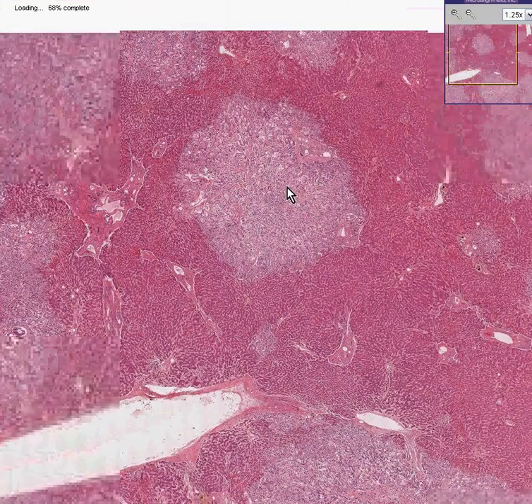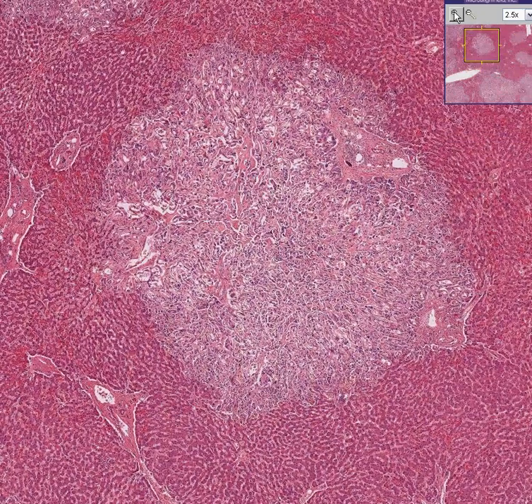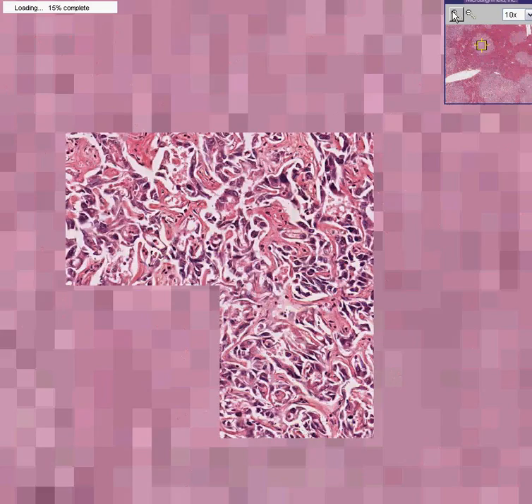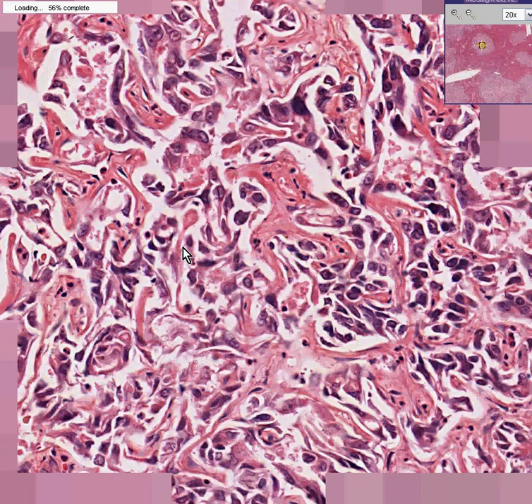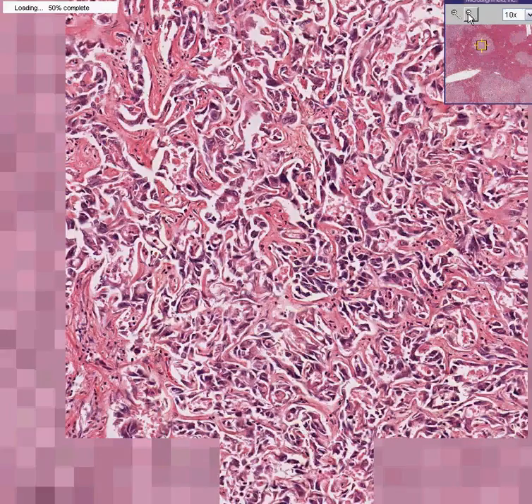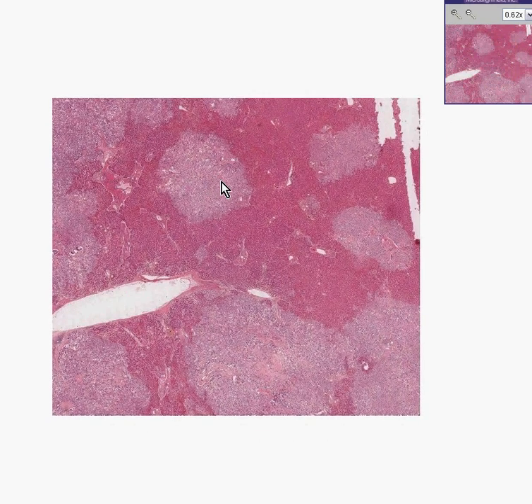as well. So, in all honesty, even though we would all like to think we are brilliant people that can diagnose anything, what you can really say truly about this malignancy is that it looks kind of glandular. It infiltrates between fibrous tissue, and it's a malignant glandular infiltrating process. And that's true whether you are looking at this nodule or this one or this one or this one or this one. Really, you don't know whether it originated in the bile ducts or originated, for example, in the colon and spread to the liver.